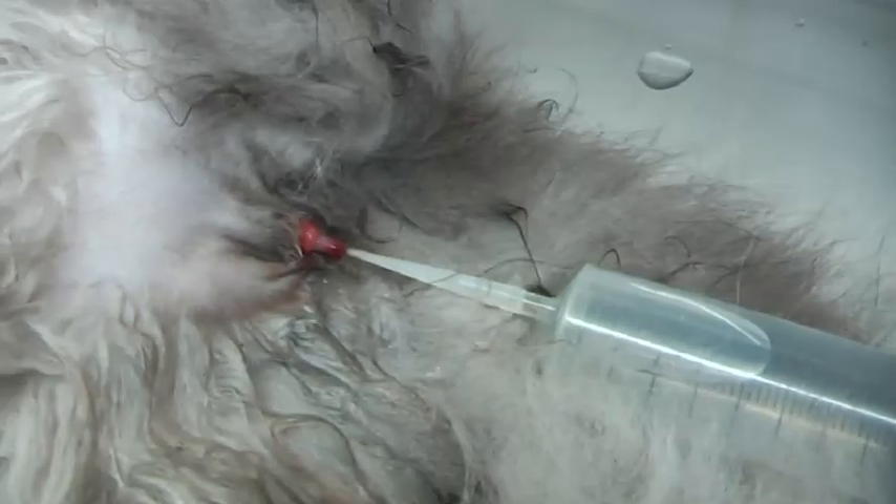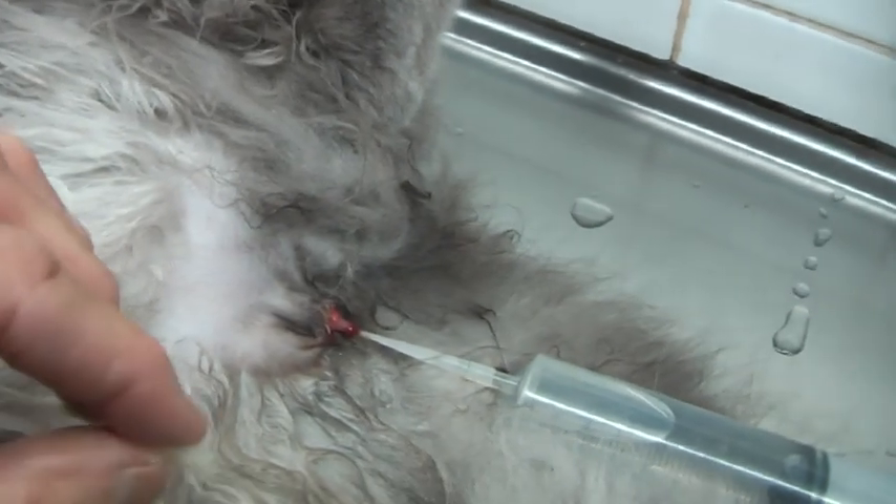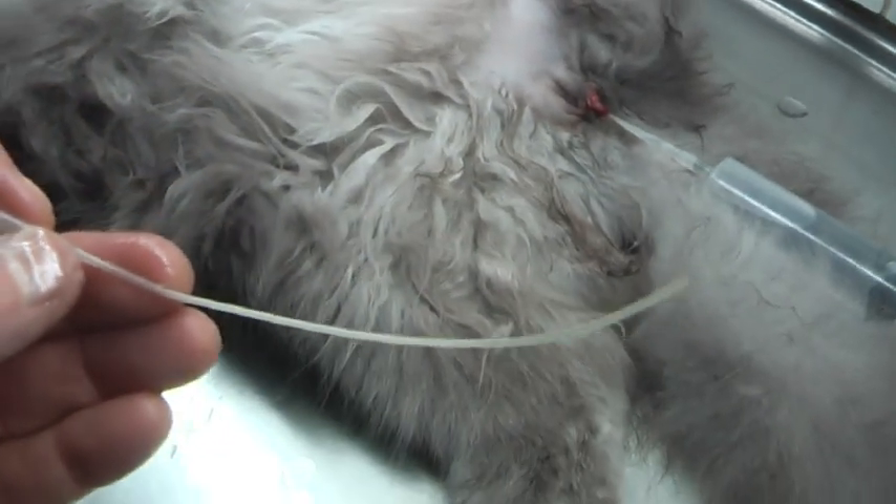I have to rinse several times now. See? Rinse, and you go on all the way. It's quite a long thing — quite a long way. You have to go in all the way, right into the bladder.